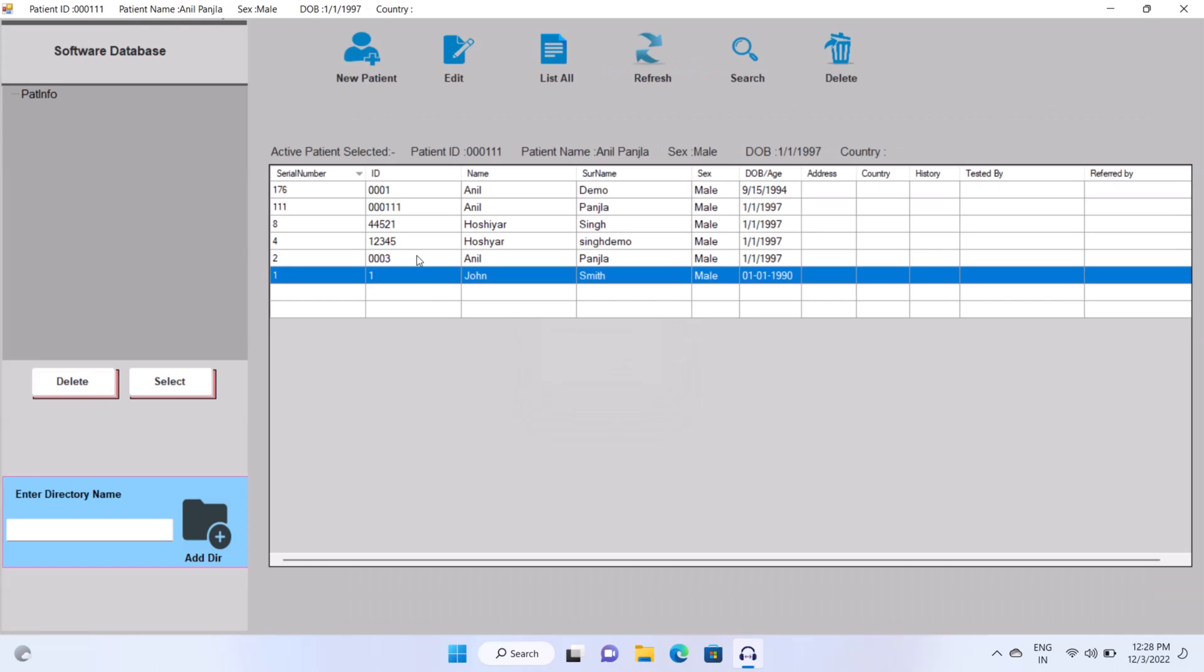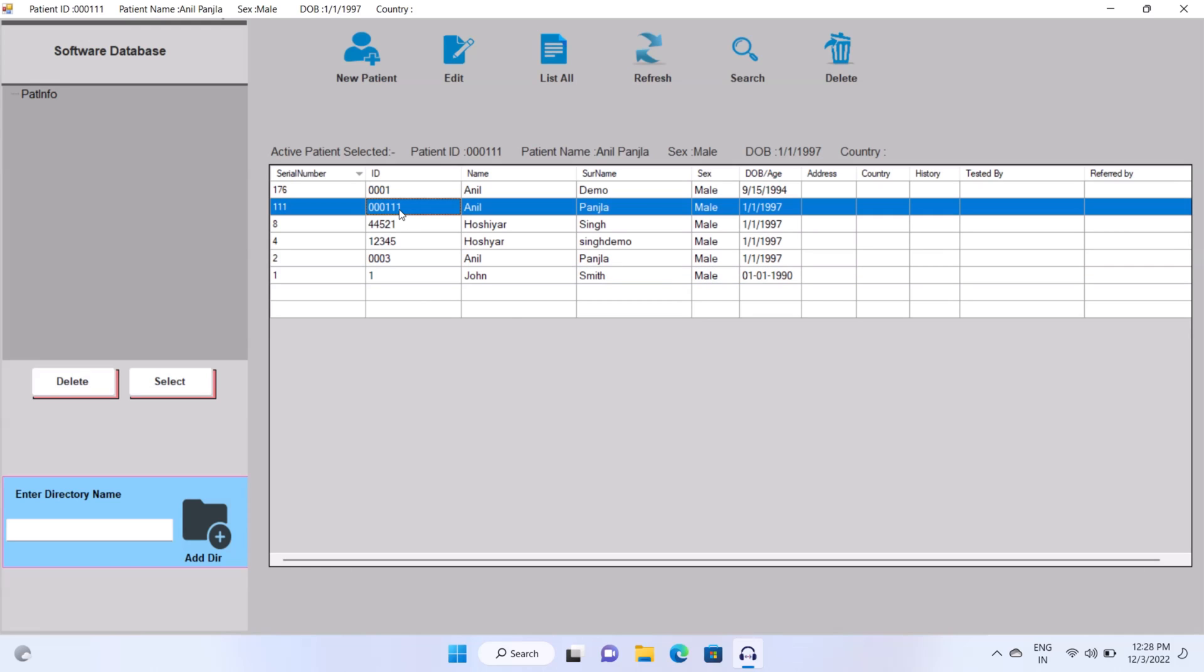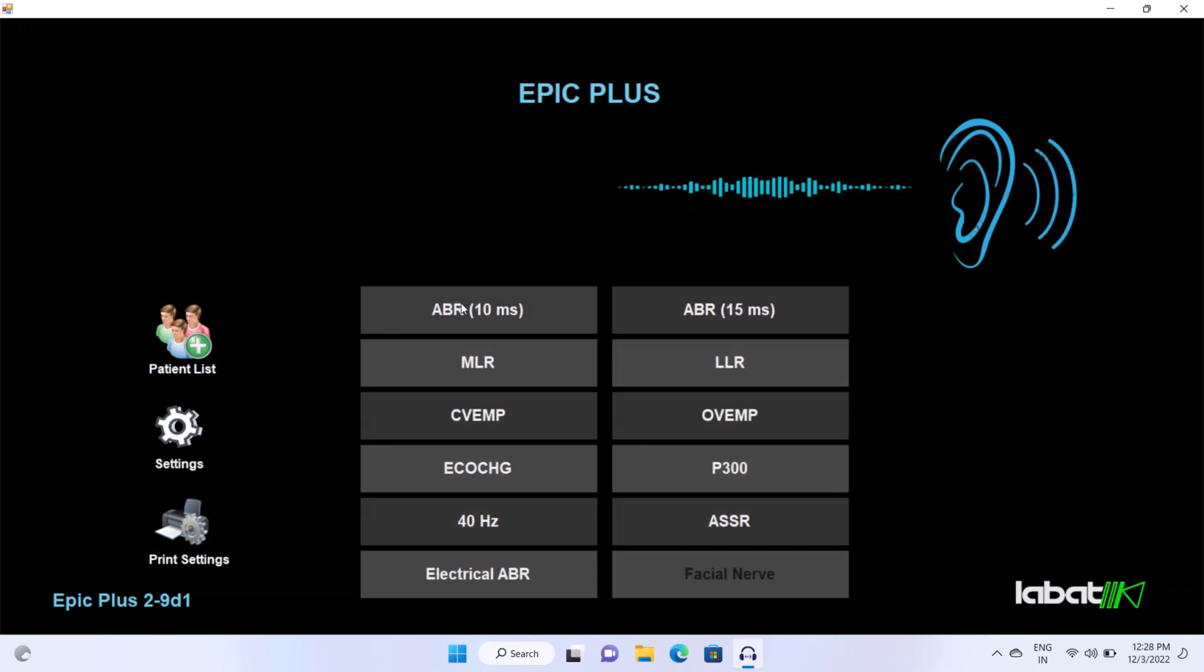Select the created ID. If you are doing test on neonate, then click on ABR 15. Or if you are doing test on adult, then click ABR 10.